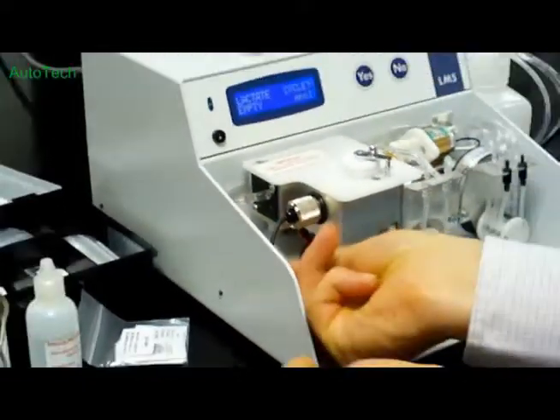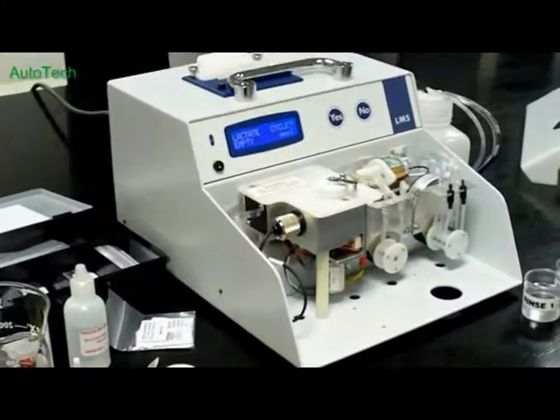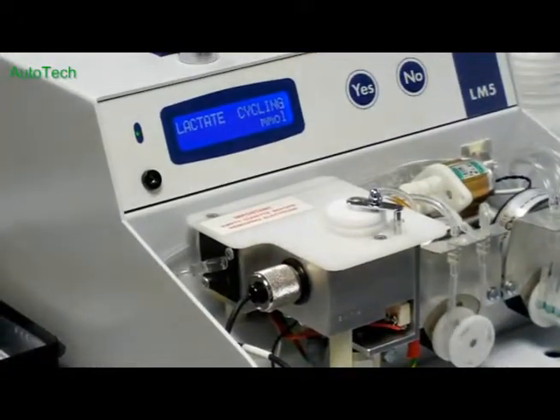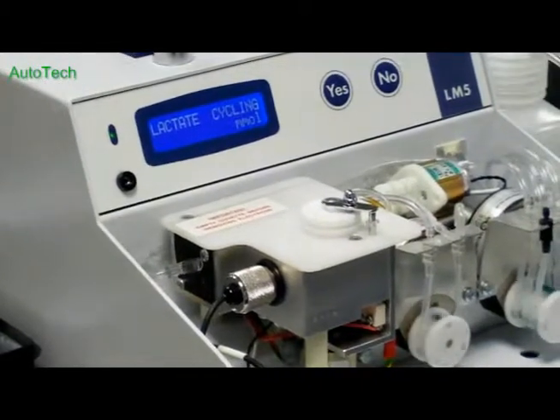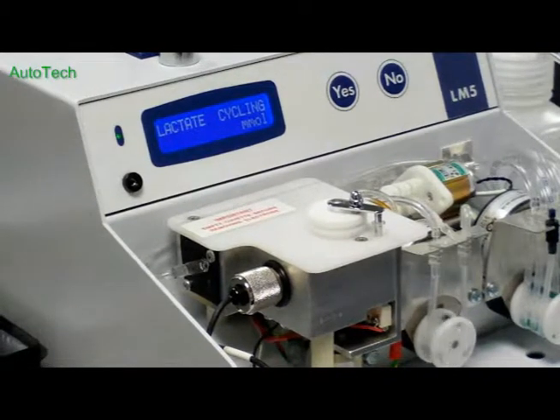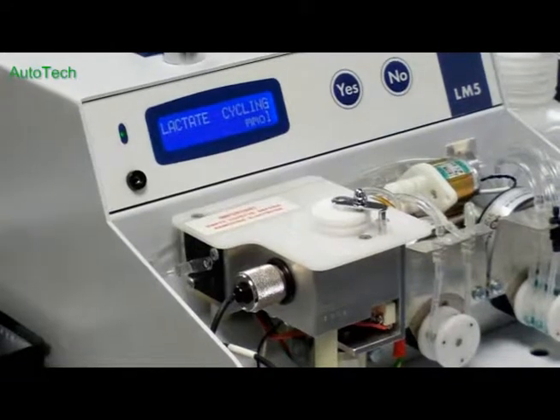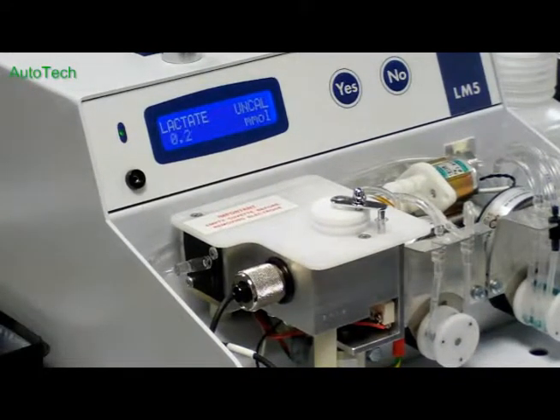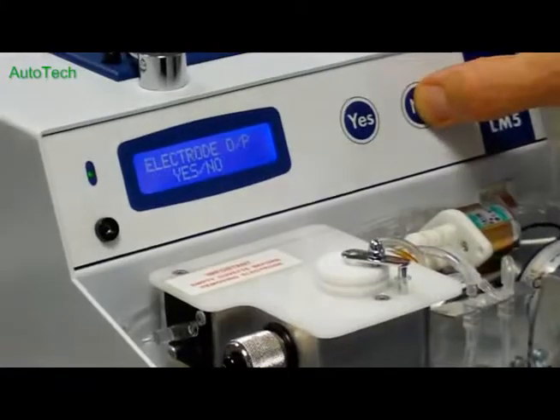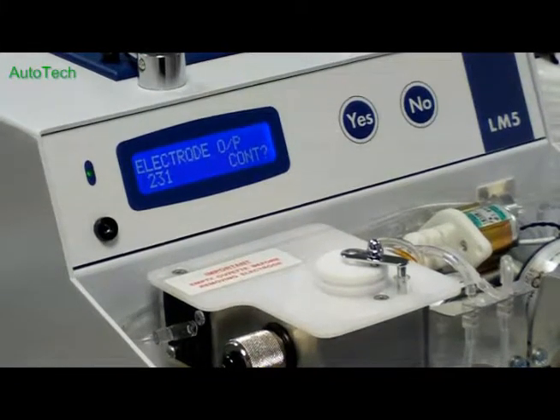And now reconnect the bulkhead connector. And now we can perform a cycle to refill the chamber. Now it will take roughly 20 minutes for the electrode to stabilise after being made up. So if we have a quick look at the electrode output by going through the menu. Electrode output. And already it is stabilised, and that is a normal reading.